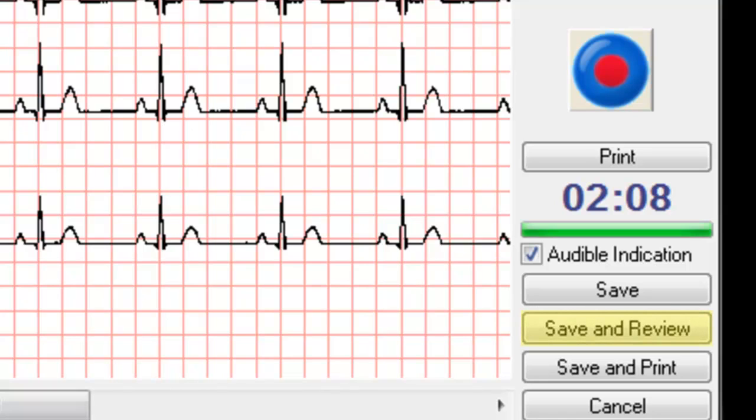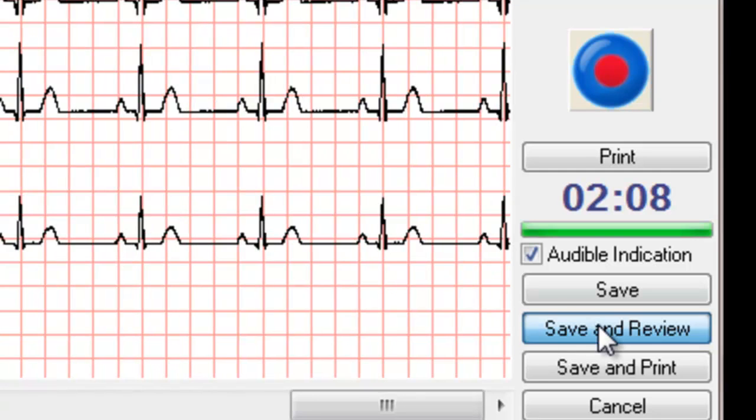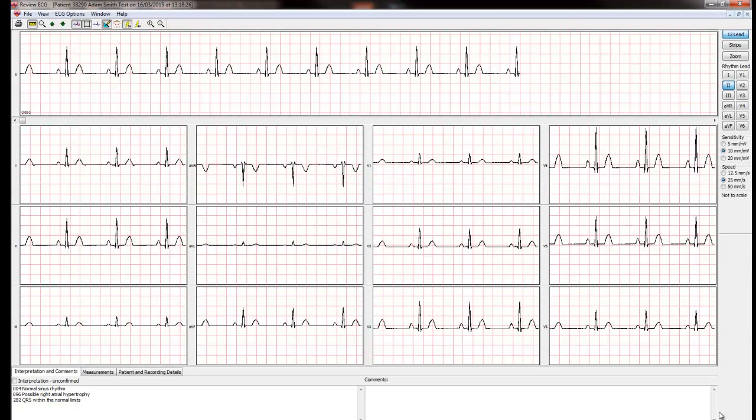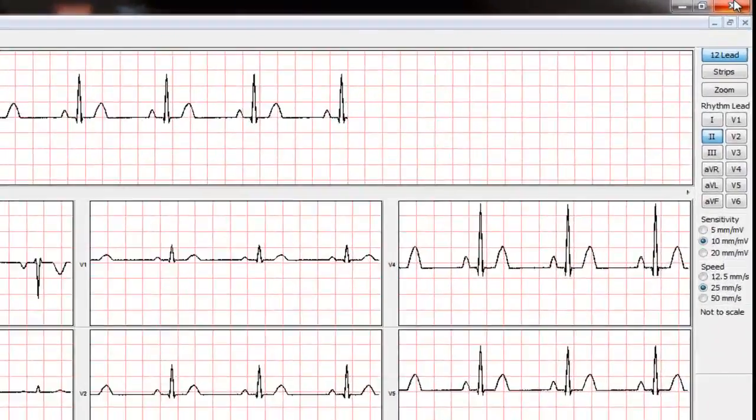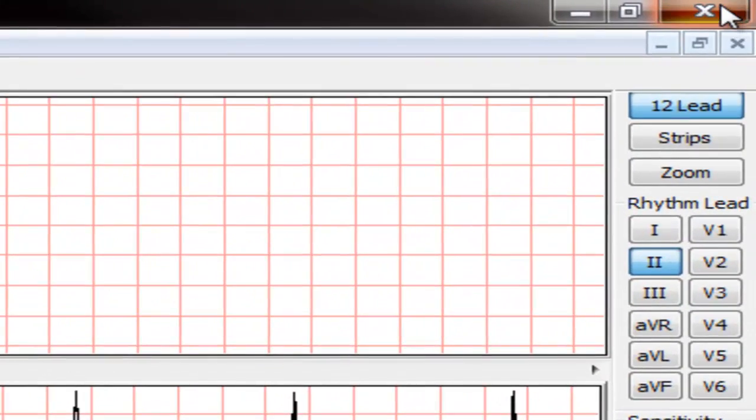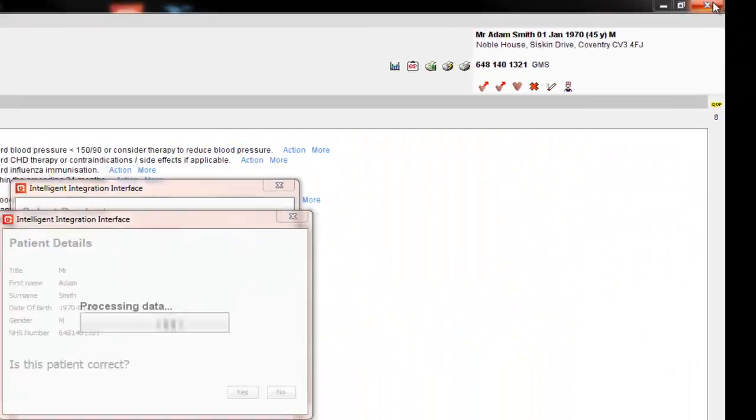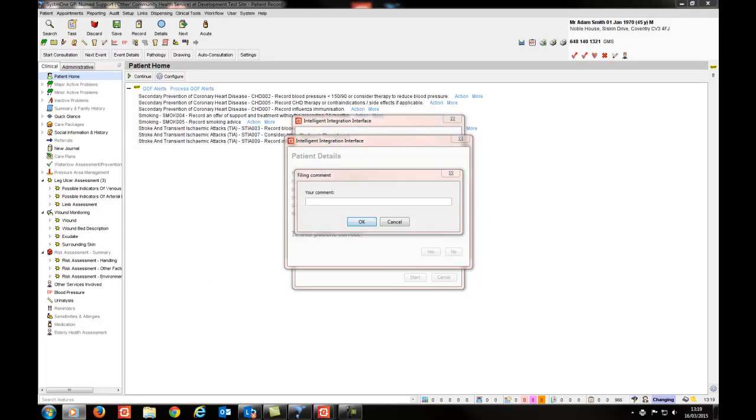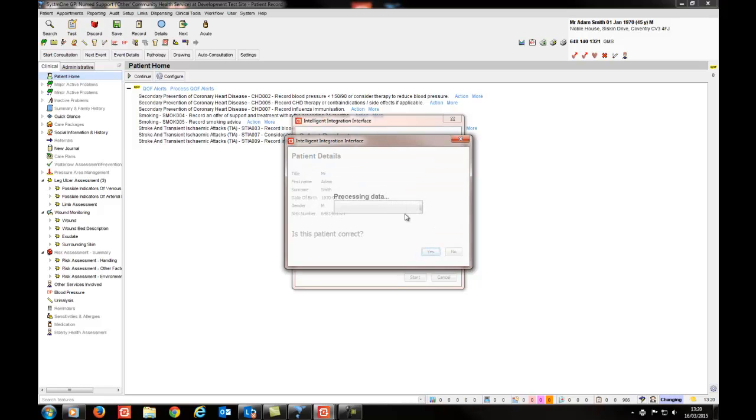If the Save and Review option is selected, then the CardioView file will appear. To file the results, close the software by clicking the cross to the very top right-hand corner of the screen. You will then be taken into the filing process. Enter a comment if required. Click OK and wait for the confirmation message that the filing of the report into System 1 is complete.